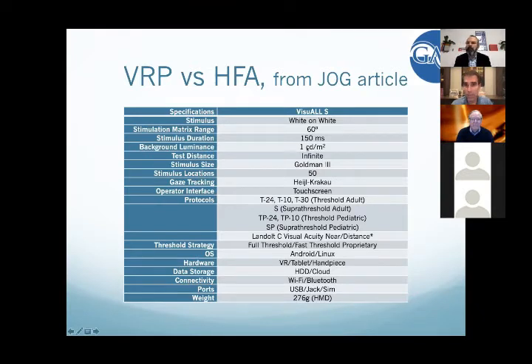Teresa, I appreciate you asking your first question, which was, can the patient wear progressives or bifocals during the test, or reading only? Actually, they want to use their distance vision, so they can use just the top part. It should not matter because they're actually focusing on infinity. And Alberto and Ron are also well versed, so please, if I say anything that may not be truly accurate, please correct me. But that is what we were told.